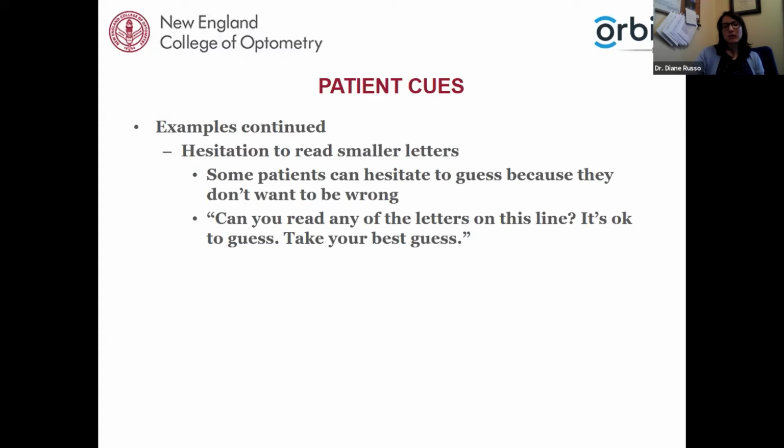I notice a lot of times when I'm working with my students, they'll say, this is what the patient's best vision is, and then I'll come in and encourage them in that way. It's okay to guess, give it your best guess, try, isolate the line, isolate letters, and more often than not, the patients will be able to read more of the letters than they think. Some of this can be that they don't want to guess, they don't want to get it wrong. So if you're telling them that it's okay to guess, it gives them that permission to try, and then you take that into account when making your refractive decisions.